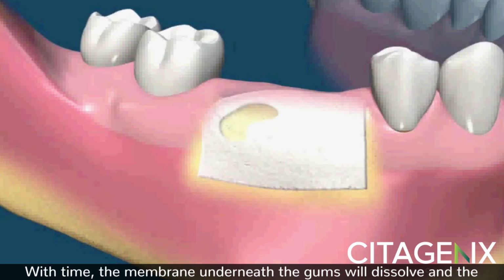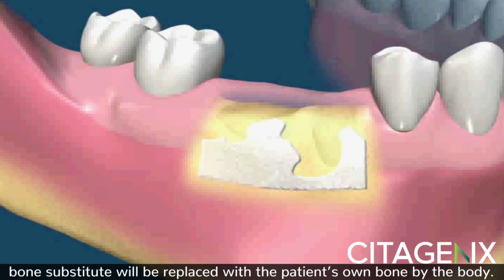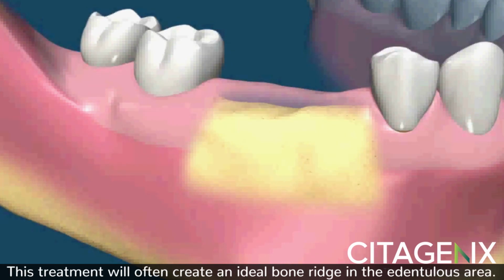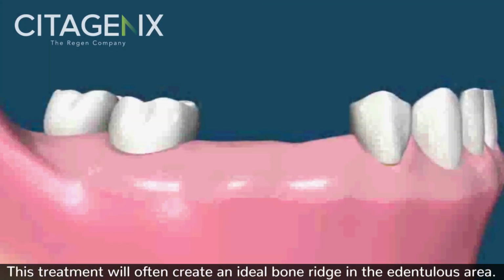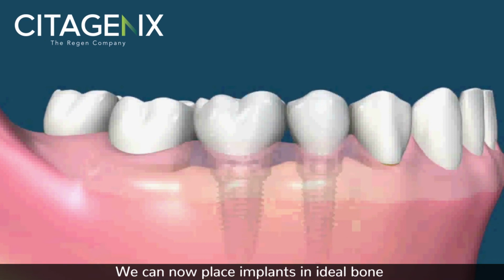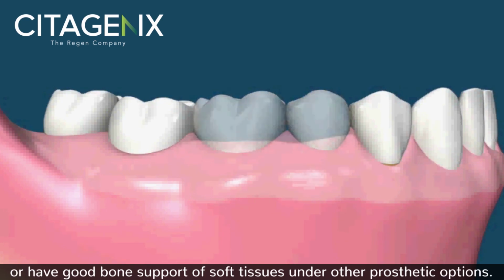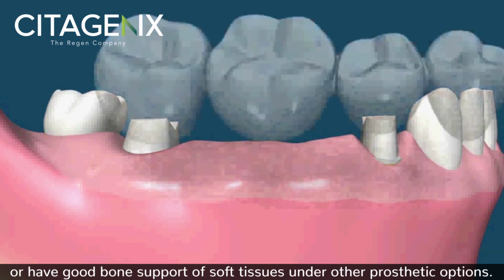With time, the membrane underneath the gums will dissolve and the bone substitute will be replaced with the patient's own bone by the body. This treatment will often create an ideal bone ridge in the edentulous area. We can now place implants in ideal bone, or we can have good bone support of soft tissues under other prosthetic options.